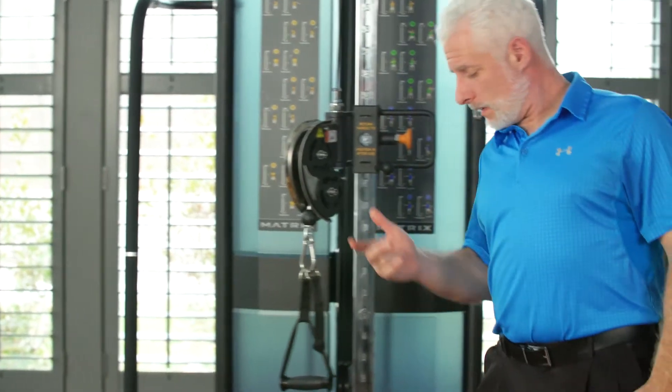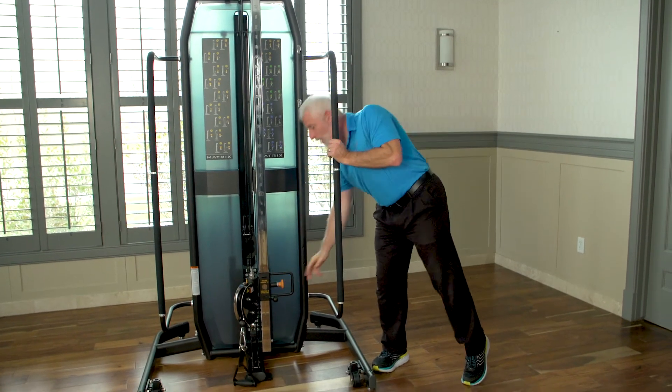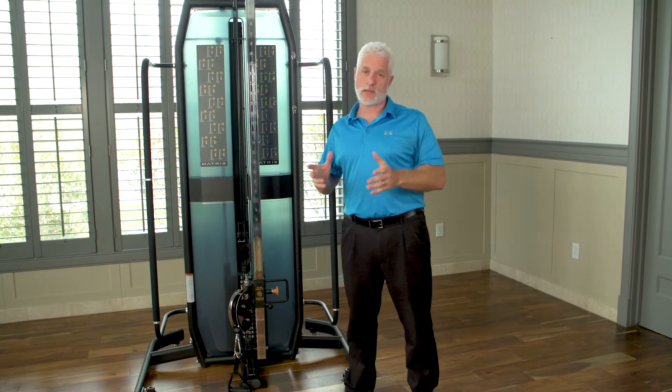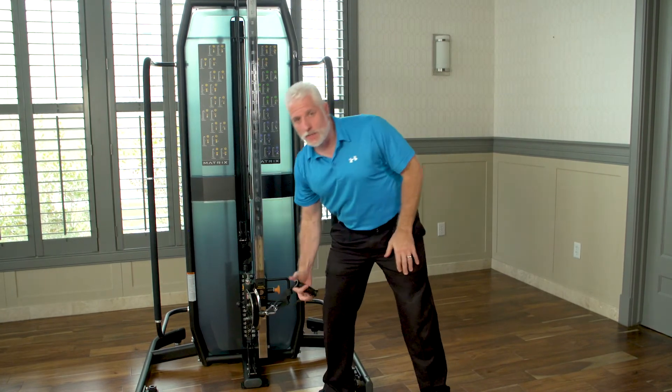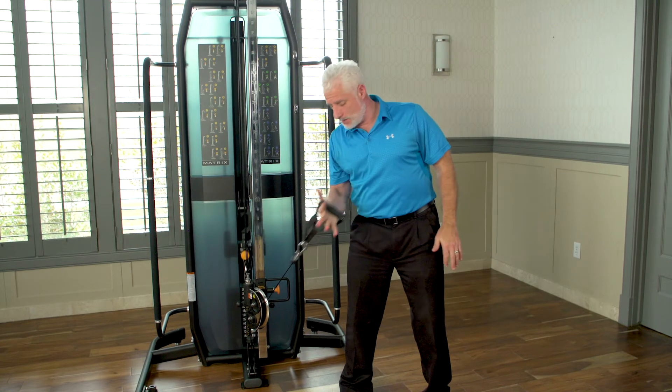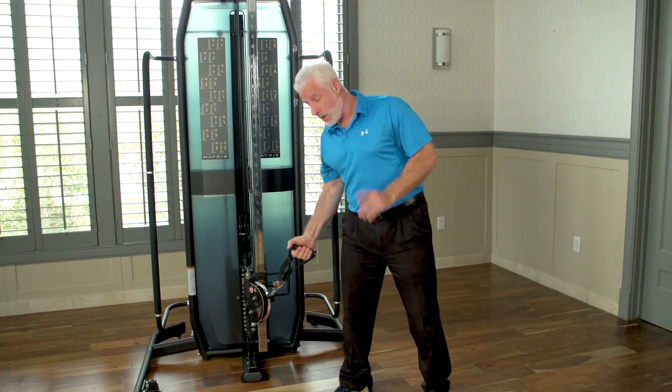What I also like about it is you can go to the bottom of the pulley for PNF patterns. As we all know as physical therapists, PNF patterns are a very strong part of what we do — you just grab the pulley and come up and down.